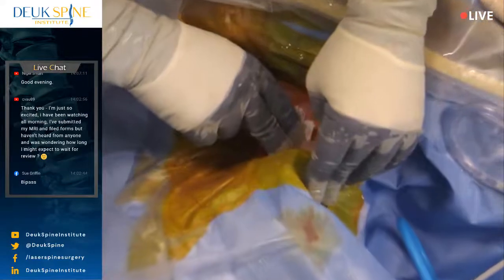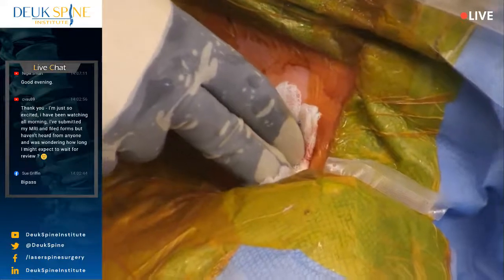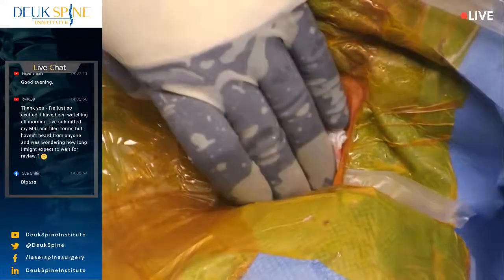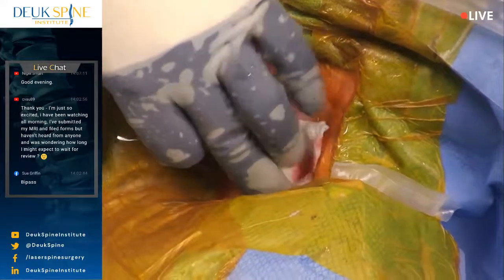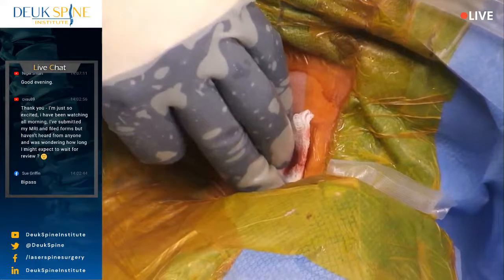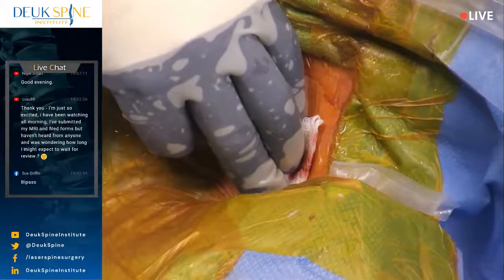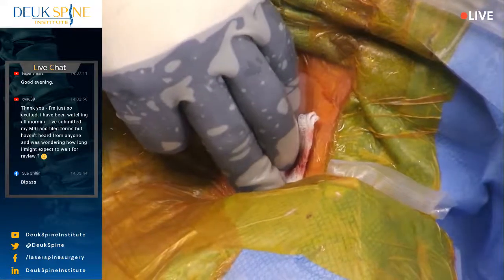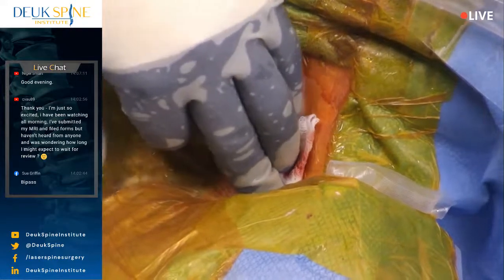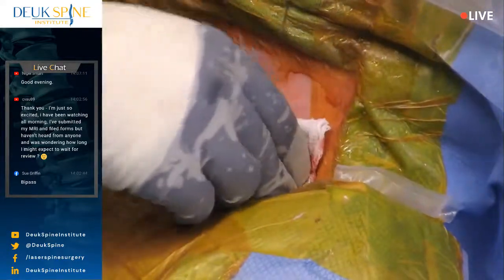So I'm just going to apply pressure for another minute. It usually takes about 5 minutes before venous bleeding stops. That can be affected, of course, by medications the patient takes. So they take aspirin. Even if you stop aspirin a week before surgery, it still has an effect on platelet function for about 30 to 45 days. So if you really want to get rid of the aspirin effect on your platelets and bleeding, you have to stop for at least a month and a half to 2 months to be sure. But it definitely has an effect on platelet function. Remember, your platelets are the first thing your body does when it has a tear in a blood vessel.